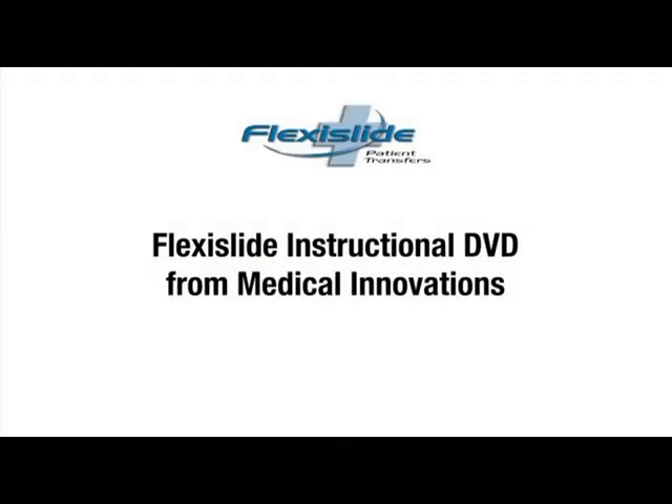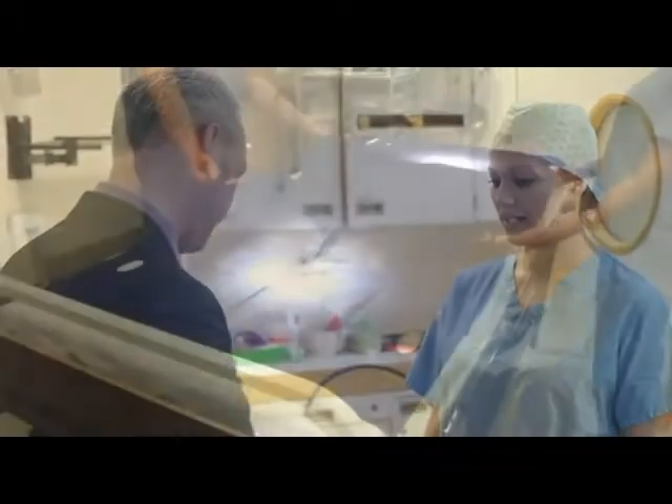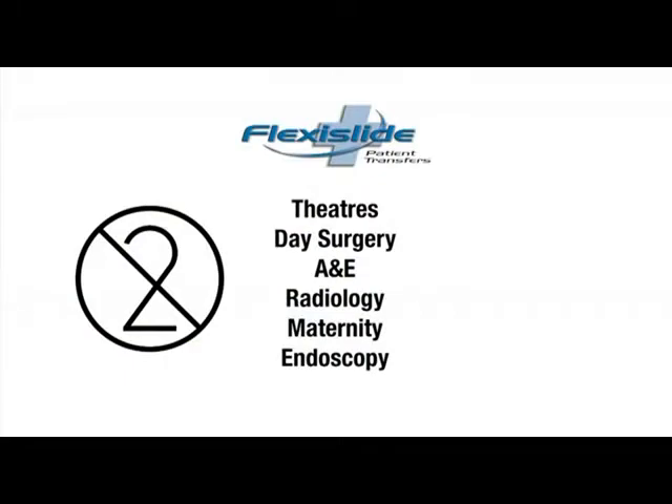Welcome to the FlexiSlide Instructional DVD from Medical Innovations. FlexiSlide is a single-use patient lateral transfer sheet ideal for departments across the hospital, but particularly designed for use in procedural environments such as theatres, day surgery, A&E, radiology, maternity and endoscopy.